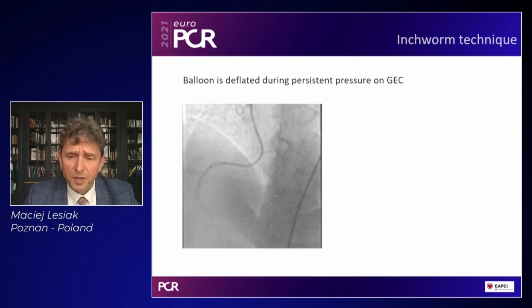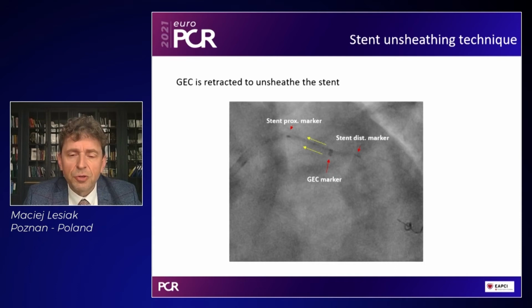And finally, once you cross the lesion, you can very easily position your stent distally to the target position.